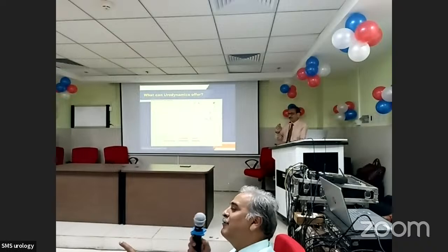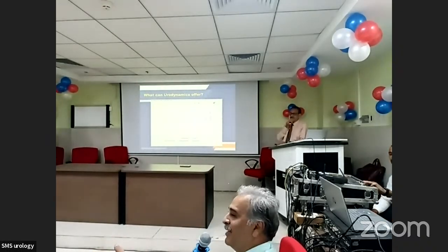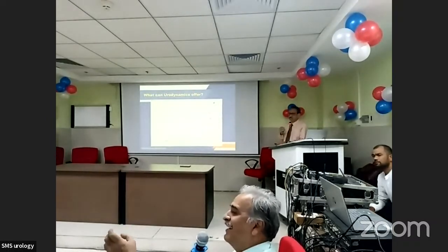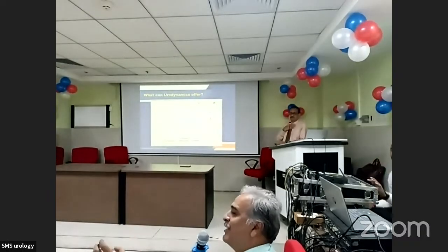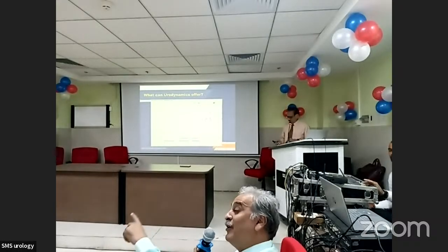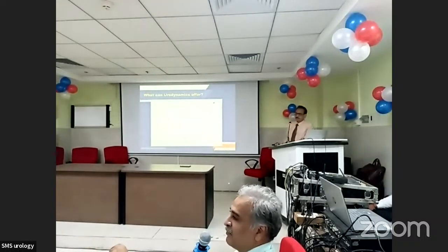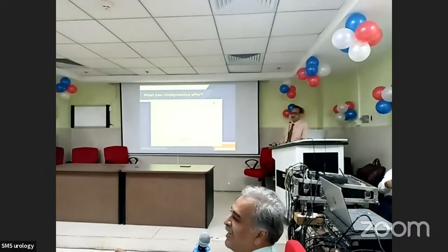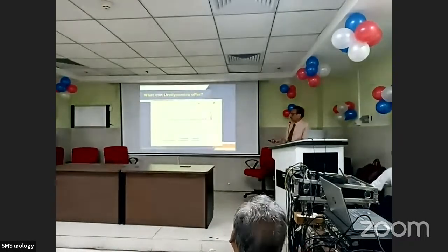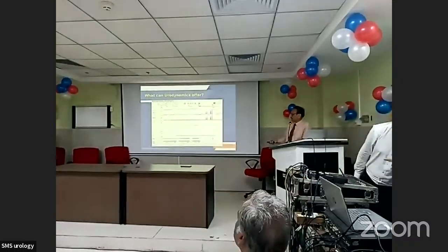This will always be associated with urgency. So then it becomes symptomatic, it is no more asymptomatic. So this contraction of EMG will always be associated with it. During the urodynamic study, the patient will complain of urgency, so during UDS you have to be aware of what the patient feels. And this is to show that the leakage can occur because of overactivity, and sphincter activity on EMG responded to that.